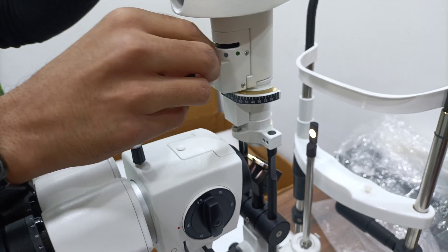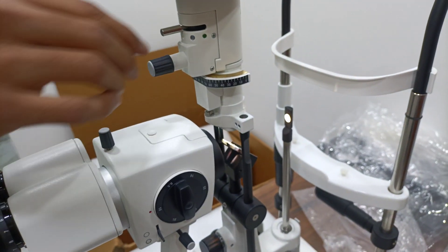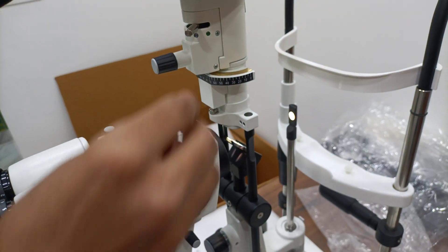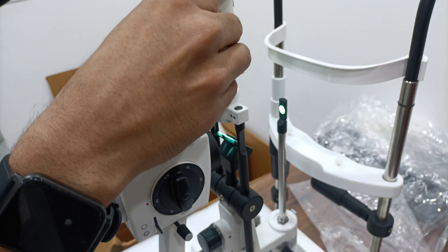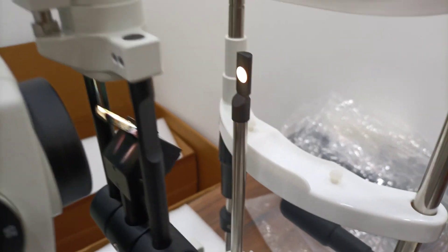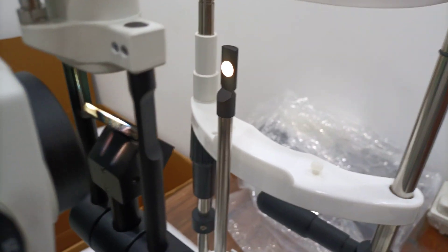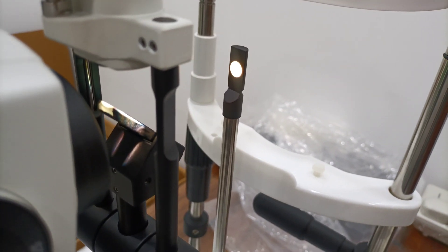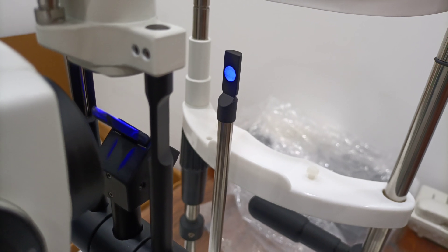Filter available. Natural white, red free, green, and diffuser. Cobalt blue.